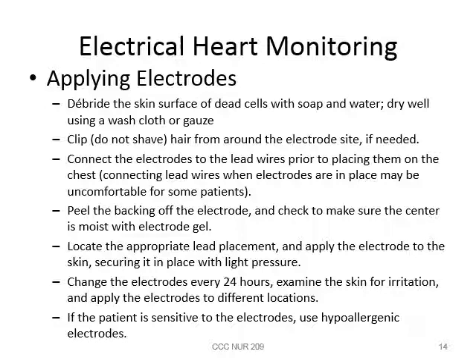Your book says change the electrodes every 24 hours. I don't see that as common practice, but you do want to make sure you're checking the skin for irritations and trying to apply the electrodes to slightly different locations. Again, not something I see in general practice, but it should be done.